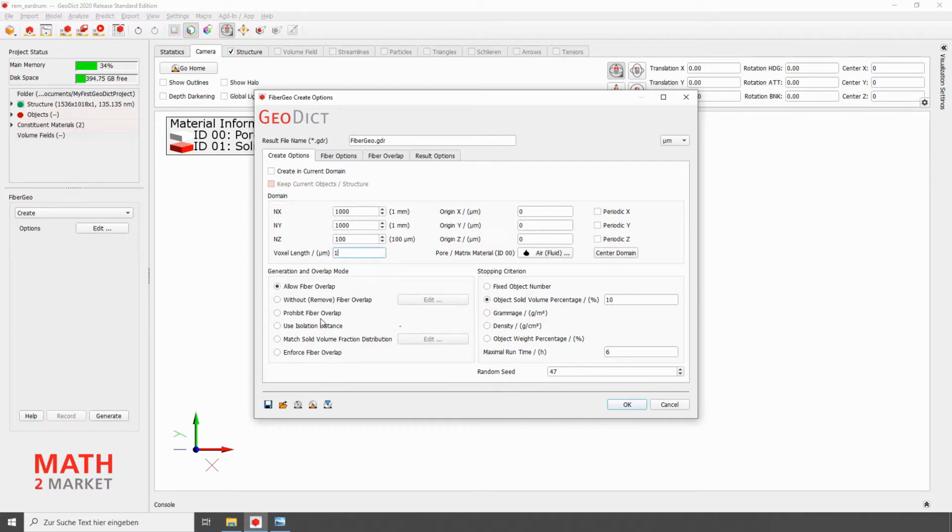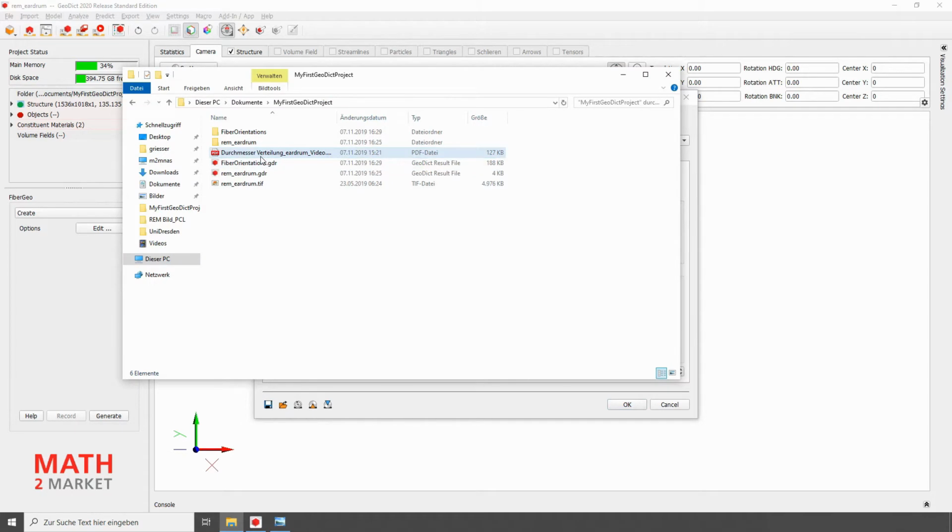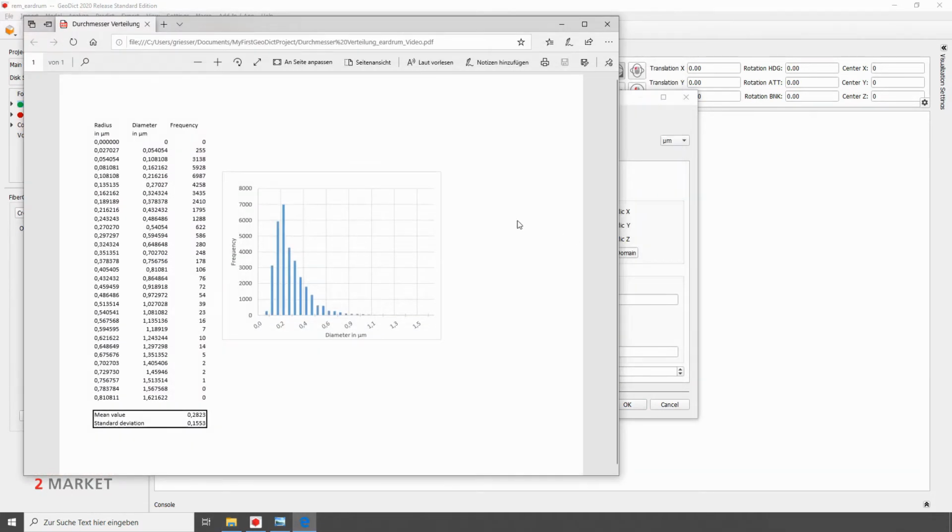Choosing the length of the voxel is not entirely free, since we have to model a certain fiber diameter distribution. This should ensure that even thinner fibers can still be sufficiently resolved. For this purpose, we use a measurement, which was also made available to us, in which the mean value and the standard deviation of the fiber diameter distribution were determined experimentally. As we can see from the distribution, it is roughly a log normal distribution. The largest peak is at about 0.2 micrometers.